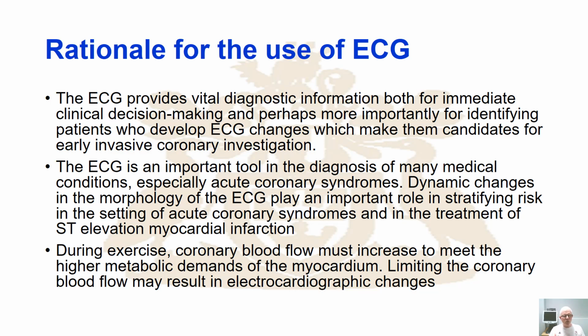So the reason that we do exercise stress testing, and this is something that will be covered in the week 11 podcast, which is on CPET, cardiopulmonary exercise testing, the reason we take ECGs during those is that when we're trying to build up a holistic picture of the cardiopulmonary health of an individual, understanding how the heart is functioning when it's placed under controlled stress is fundamental.